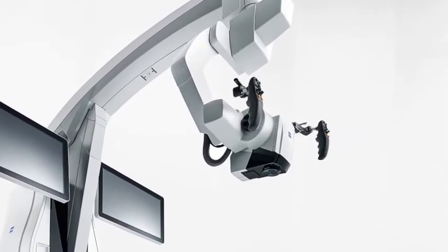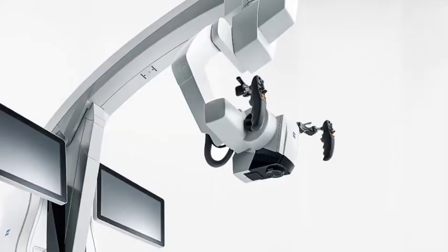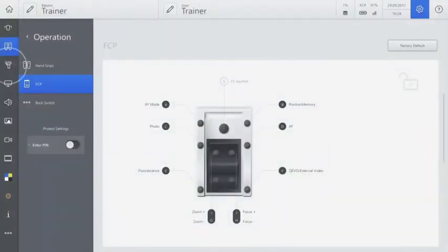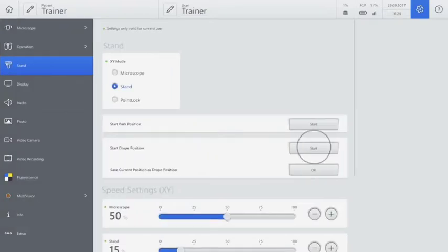To position ZEISS Kinevo 900 in its pre-configured drape position, go to Settings, go to Stand, and press Start Drape Position.